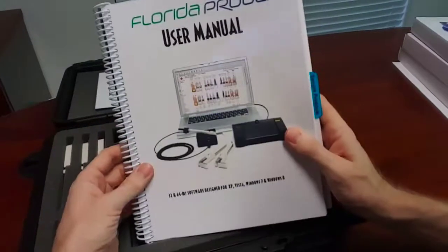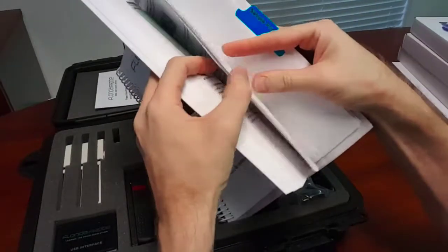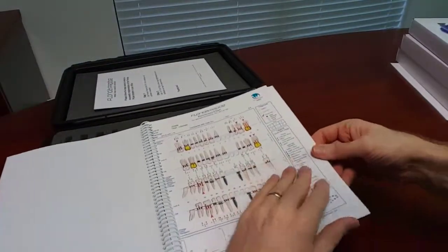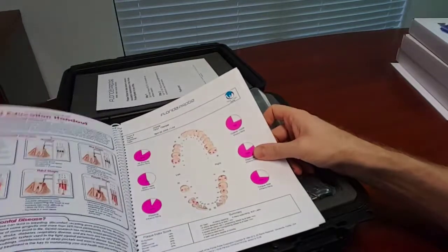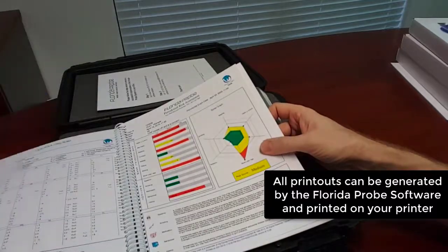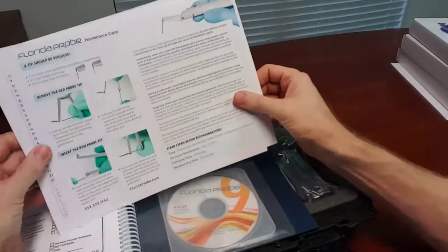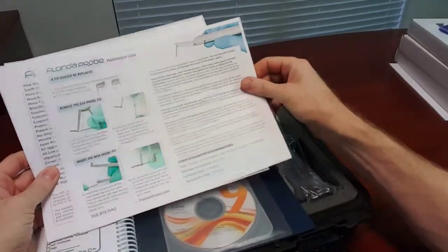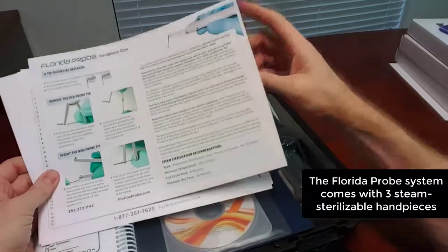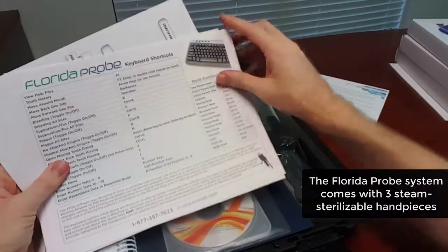Let's look at the user manual. It's over 130 pages. In the back you'll notice sample printouts that Florida Probe will print on any inkjet printer — color charts supported by Windows. In the very back there's an informational sheet about how to steam sterilize and clean the hand pieces, which is great to post up for your sterile tech. There are also keyboard shortcuts you can reference.